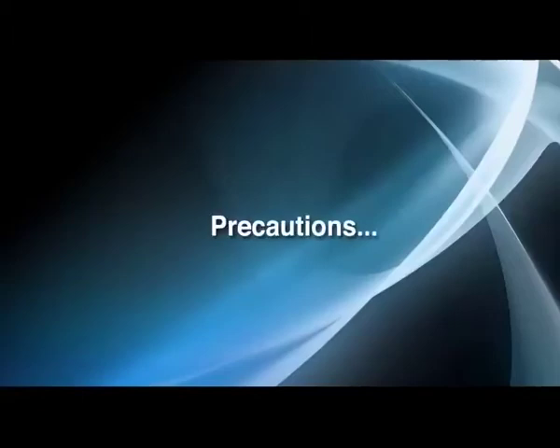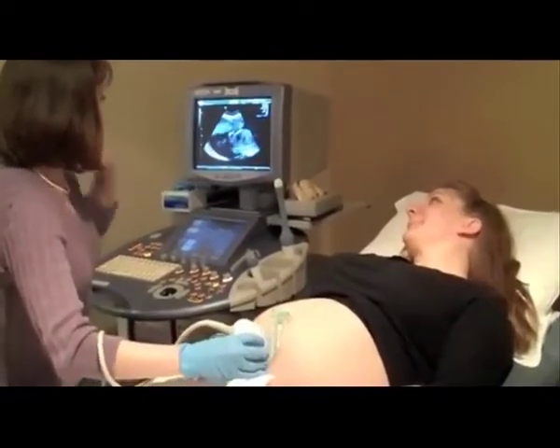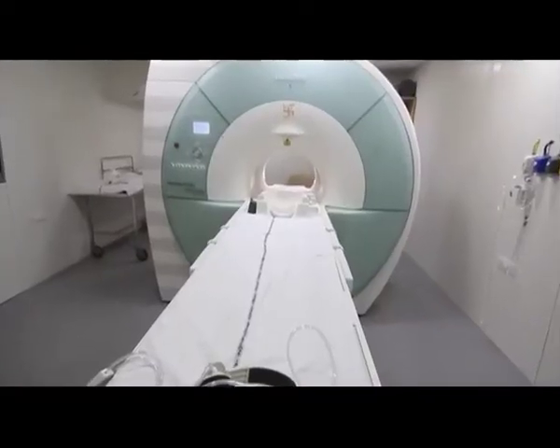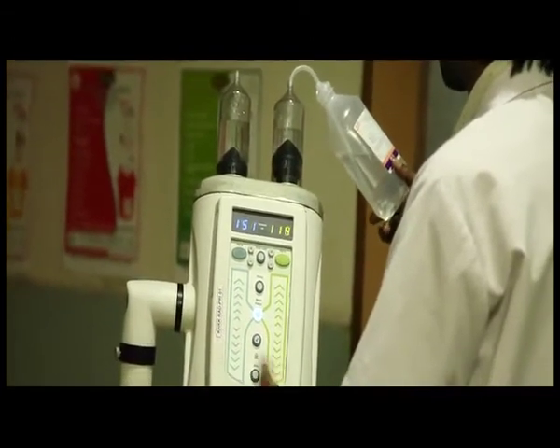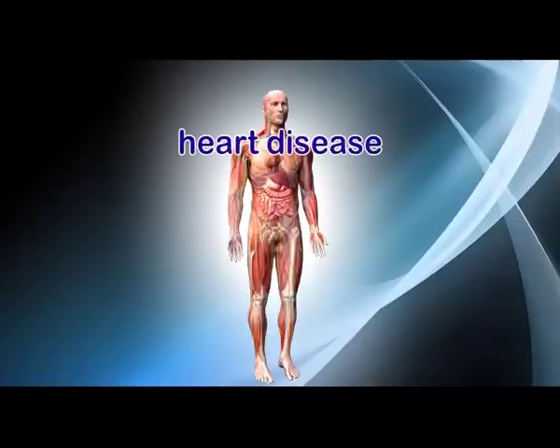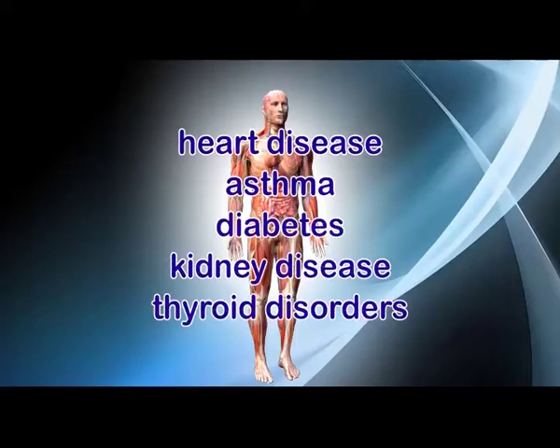Exposure to radiation in a CT is slightly more than the normal X-ray, but doctors believe that CT benefits far outweigh the risk. Precautions. Pregnant women must inform the doctor so that they may suggest an alternative method like ultrasound or an MRI scan. Rarely, the contrast material causes allergic reactions in some people. The risk is more in case of patients with heart disease, asthma, diabetes, kidney disease, and thyroid disorders.